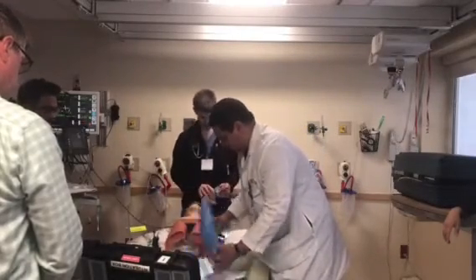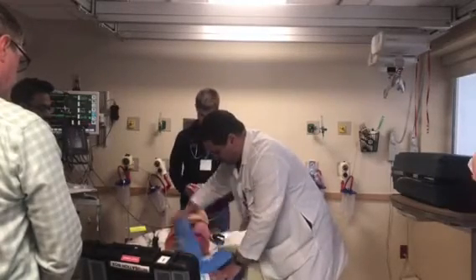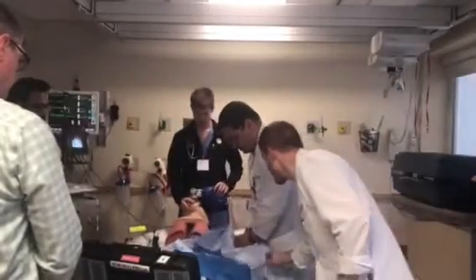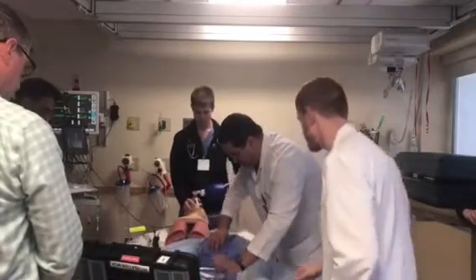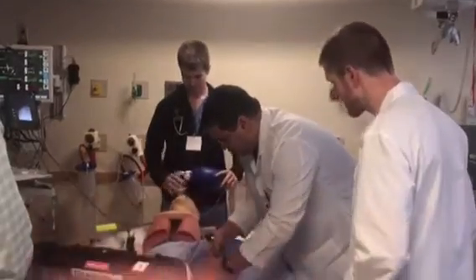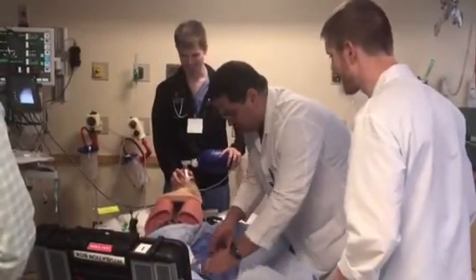All right, so let me show you what's inside here. Nobody has ever opened these kits, so that's our only chance to open those, because God forbid we open them and they need to be cleaned again. Do you know the New England Journal of Medicine video that they do about the crack? I didn't watch that one. Yeah, don't. It's wrong.